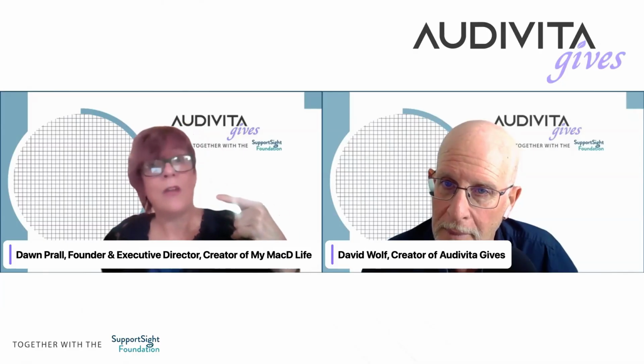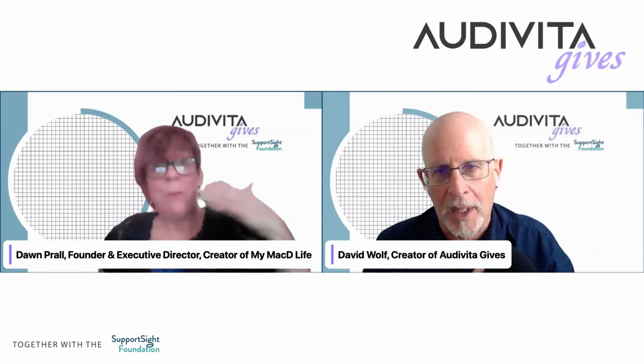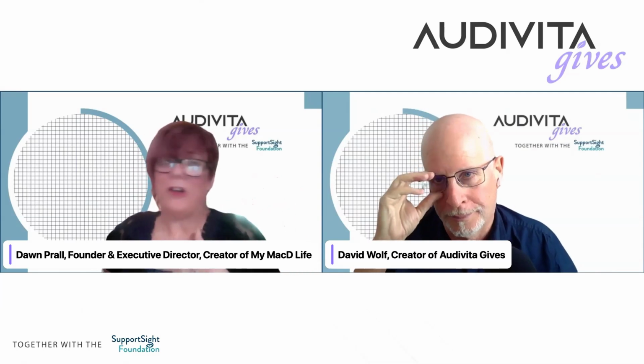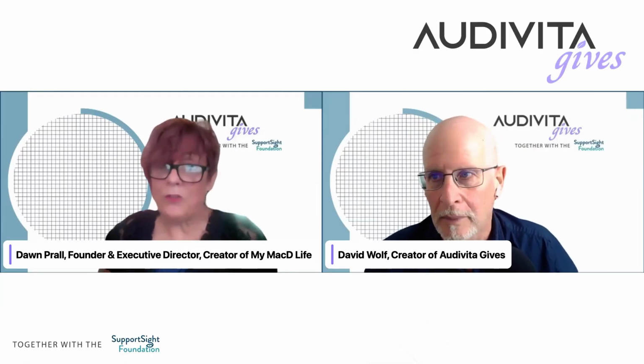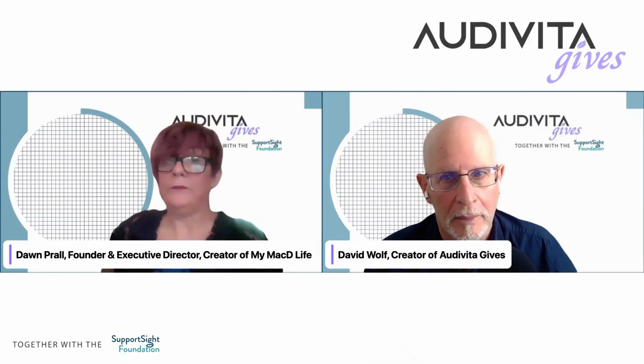Or if you're not sure if you have it, but you might have drusen. Again, this is a deep topic. The minute it's different, and let's say it's different for a couple of days in a row, just call your eye doctor. It can't hurt. It will only be good, because when you tell them you have tested with the Amsler grid, they're going to get you in hopefully as soon as they can.